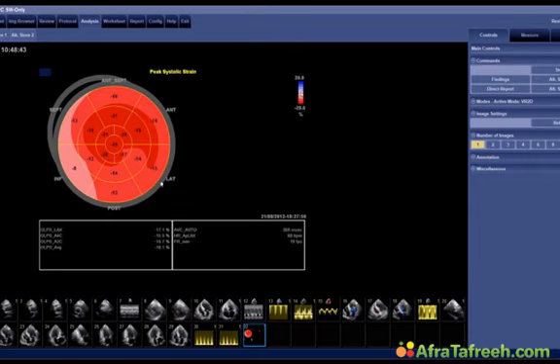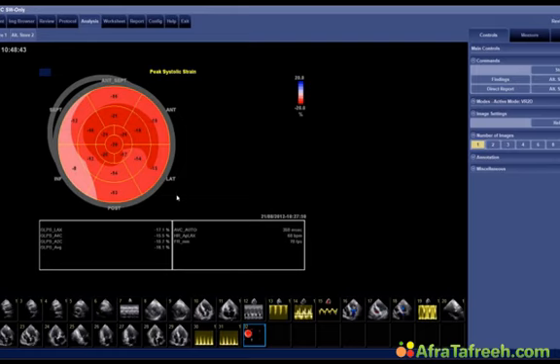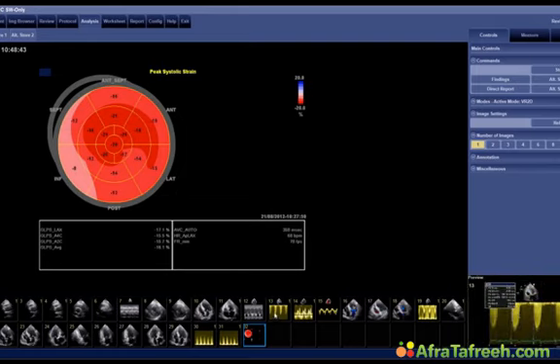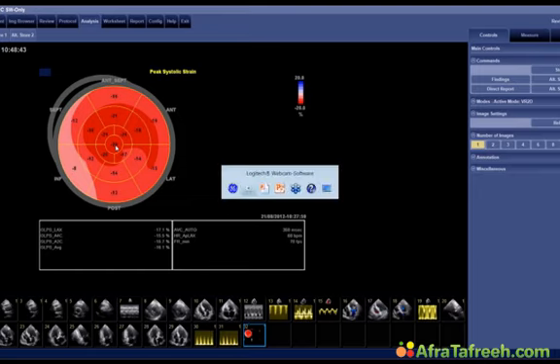And he will now get a CAT study done next week, and then he'll go to aortic valve replacement. So now, even though this patient does not have such a clear-cut indication for aortic valve replacement, he only has maybe trivial symptoms, all these other findings, namely this deterioration of longitudinal function and the very high gradient, I think is a good reason to put him to aortic valve replacement. Also, considering that the patient probably will deteriorate also with regional radial function pretty soon, since aortic stenosis is already so severe.